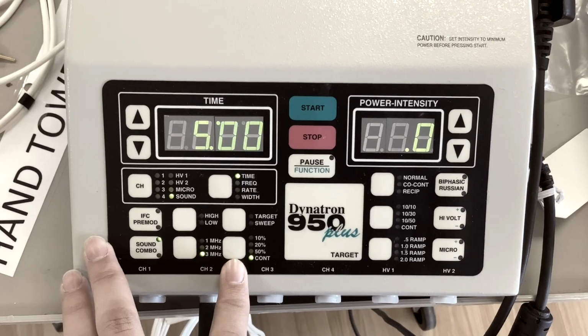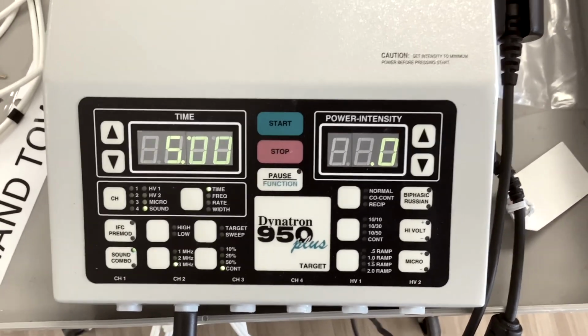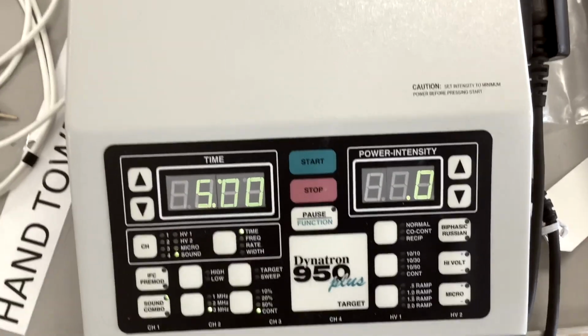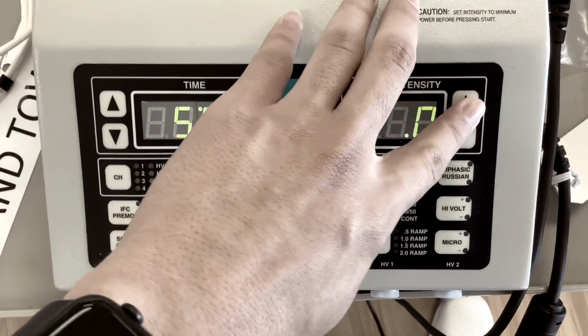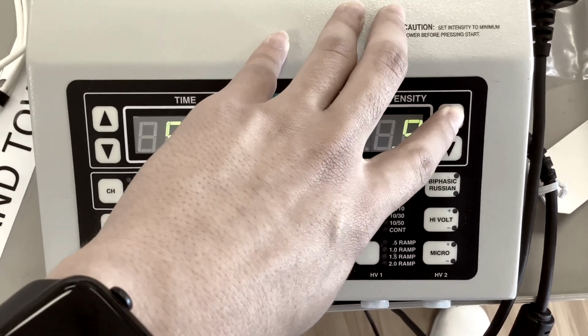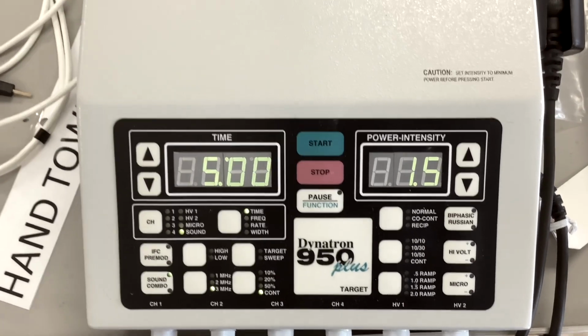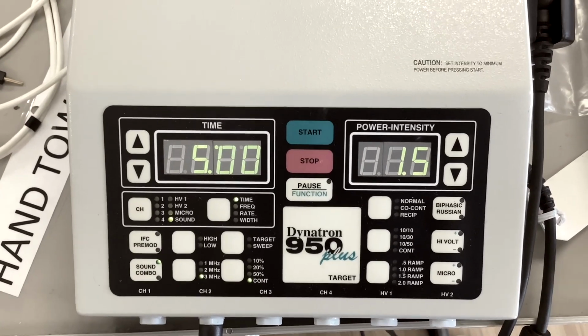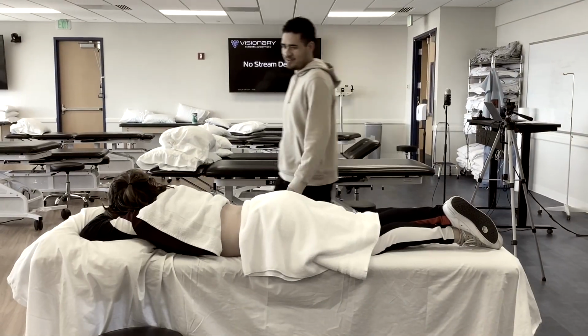I'm going to have it on continuous, that way she gets those thermal effects, because once again, she has no contraindications, and it is a chronic injury, not an acute injury. And then for intensity, I'm going to increase it up to 1.5 to start with, and then I'm going to ask her how that feels. If it's too hot, I will decrease the intensity, and if she's not feeling any heat, then I will increase the intensity.